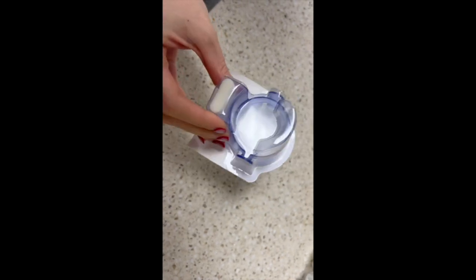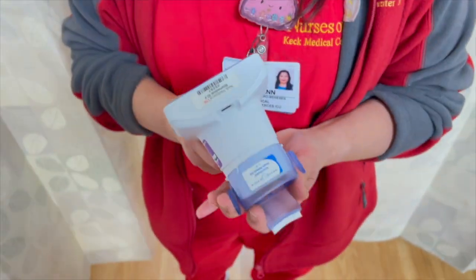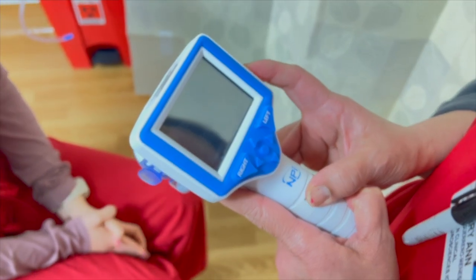Obtain a disposable smart guard and place it on the Pupilometer. This smart guard should be labeled and kept in the patient's room for reuse for the duration of the patient admission or until the memory chip RFID tag is full.